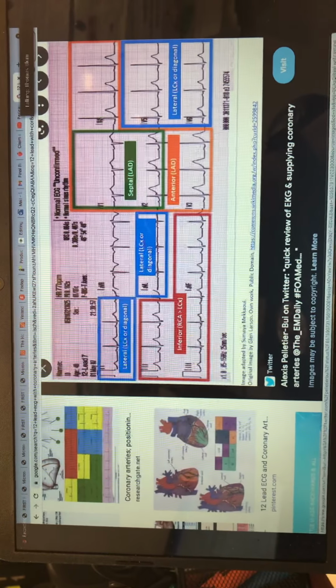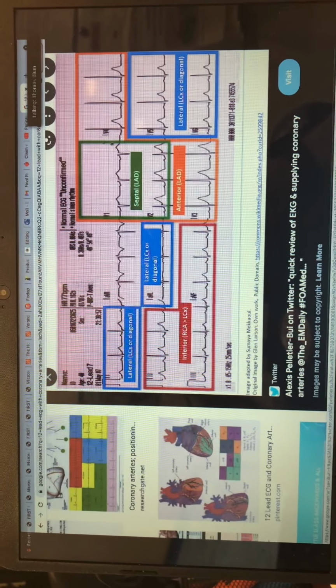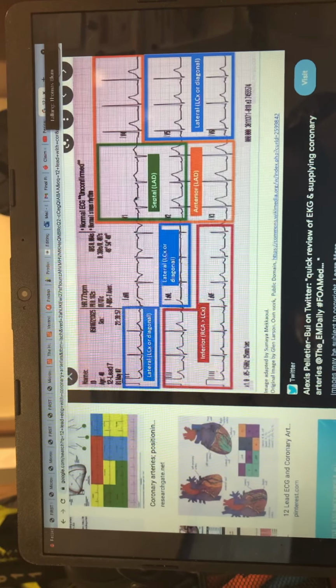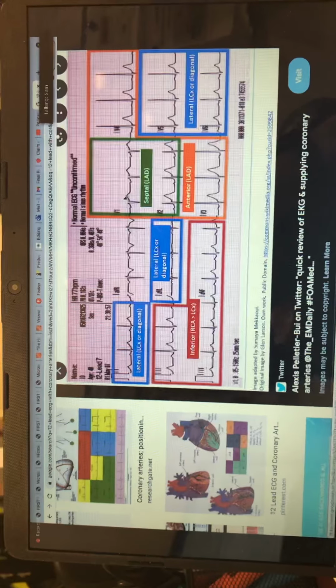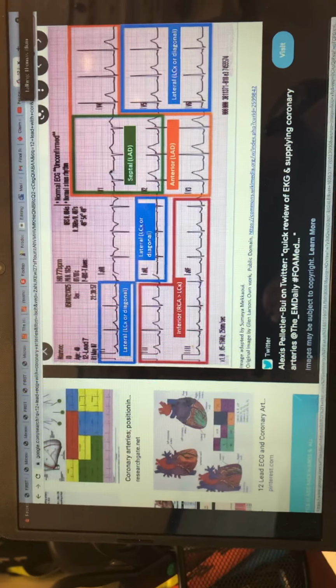Generally we do V4, and then we label that ECG as V4R and look at the V4 lead. If I move V1 from here to here, I would print out an ECG and look at V1, because now V1 is down here versus up here. Okay, I get that now. Makes sense. Good? All right, awesome.